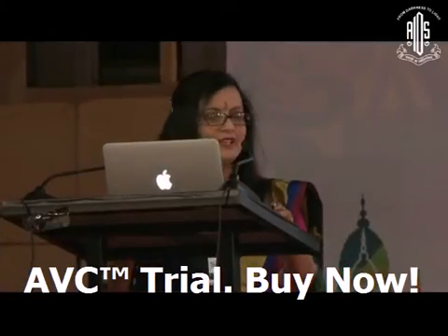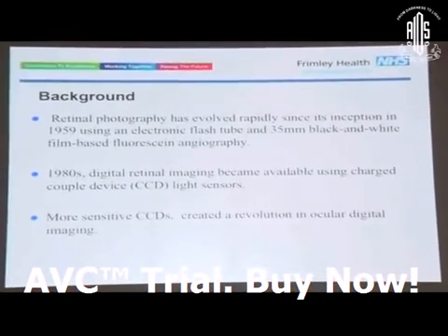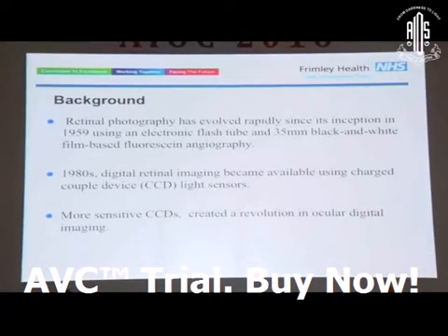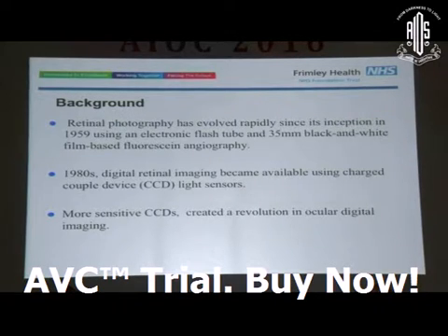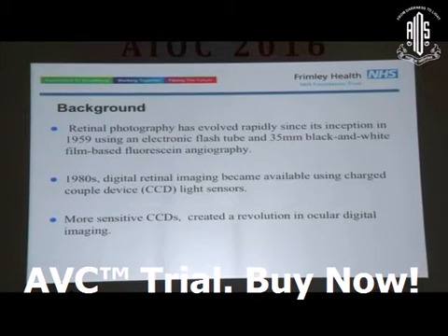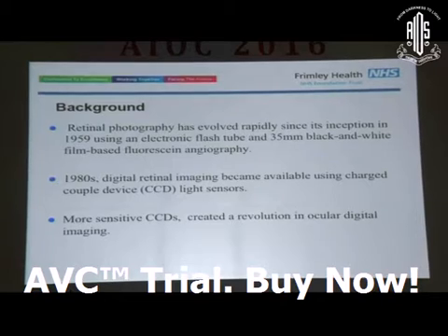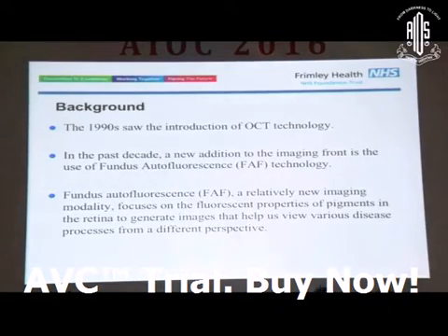Just going into the background of retinal imaging, we all know that retinal photography has definitely evolved rapidly since its inception in 1959, where we used to use electronic flash tube photography and black and white film-based angiography, fluorescein angiography. The 1980s was the era of digital retinal imaging, and that created a real revolution in retinal imaging history. In the 1990s, we saw the introduction of OCT technology, and in the past decade, there has been a new addition to the imaging front in the use of fundus autofluorescence technology.